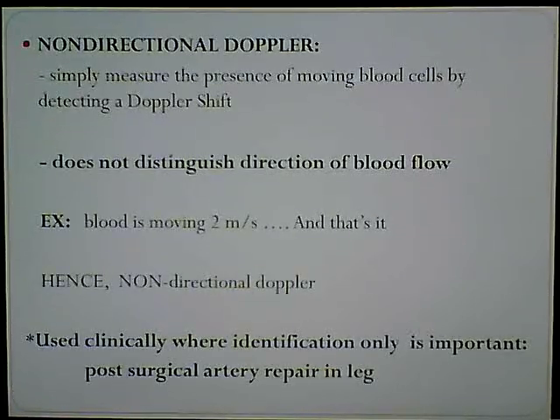They have Dopplers in the ER that patients will come in and nurses just feel for pulses in the feet. Well, I'm having leg pain. Well, the first thing you think is, okay, it might be a stenosis. Let's check for pulses. Well, we can't feel one. Let's get our little Doppler out and see if it's there. If they hear it, they're cool with it. If not, they call us in and we go look for it.